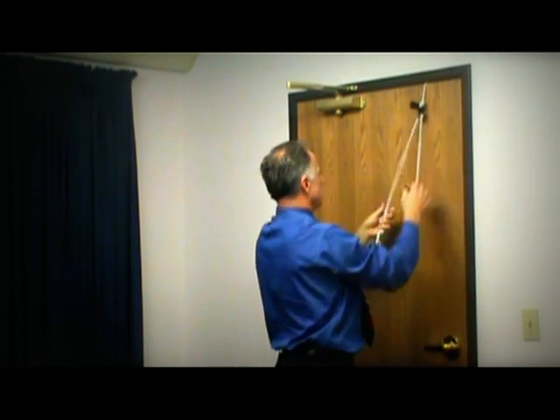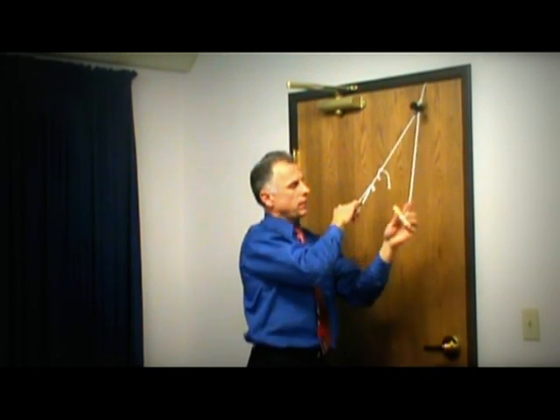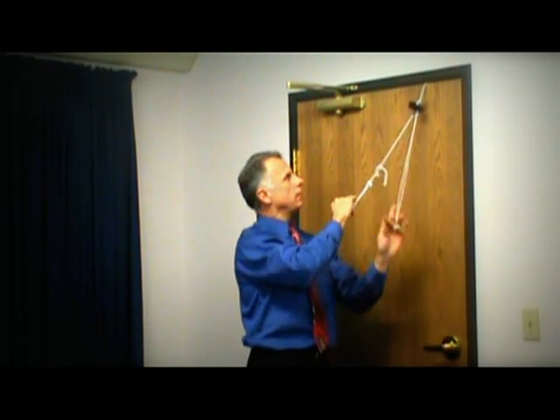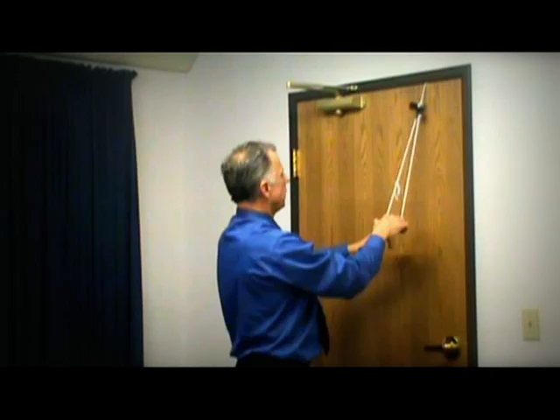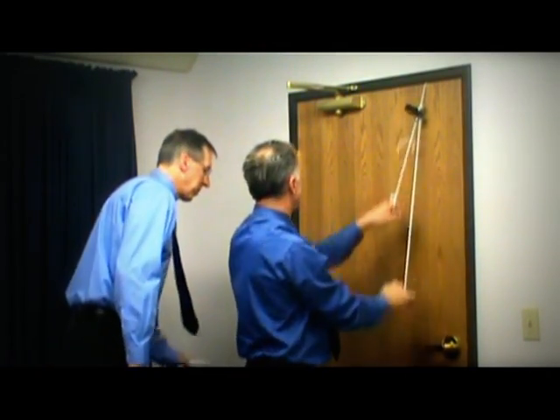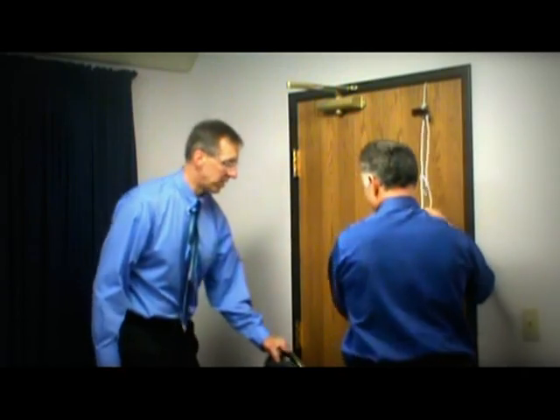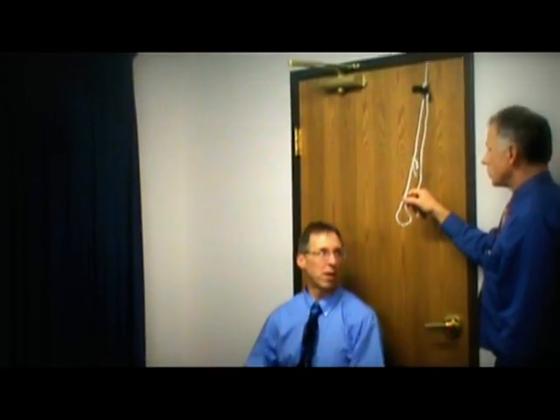You get your knot, so it hangs all the way over there. Close it in there. Here's the homemade loop for one hand, and then you can use a piece of wood like this. Or PVC. And obviously this rope is too short, but, you know, here we go. And generally I have people sit with a chair facing away, and they can go like this, and then if they even have a TV or something, they can just sit up like this and hook up.